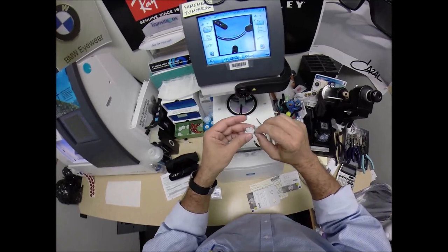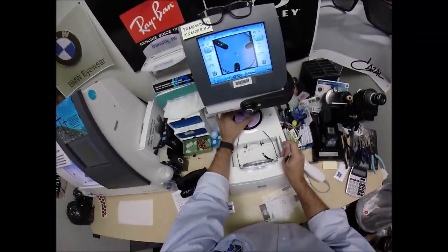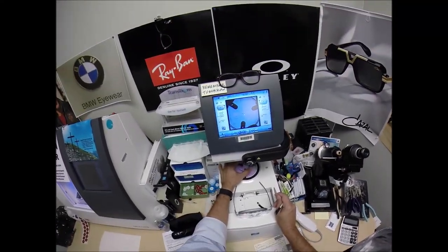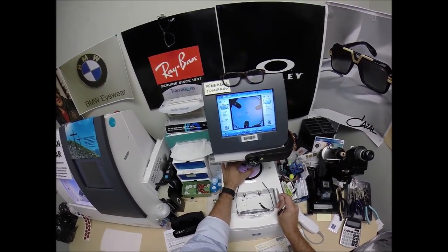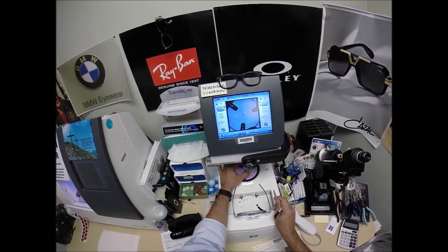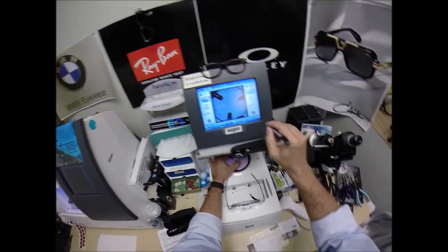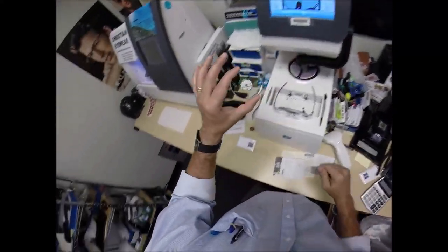The magnet is going to do its job twice. The first time it's going to attach itself to another magnet there in the arm. The dots on the lenses tell me how to orient the lens to be cut. We're going to get everything laid out. I'm going to hit that button. The arm comes down and places the block onto the right lens.